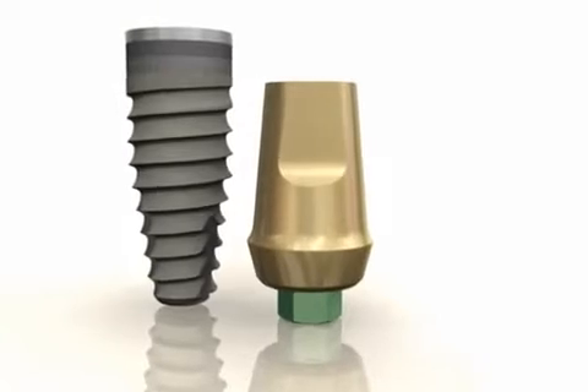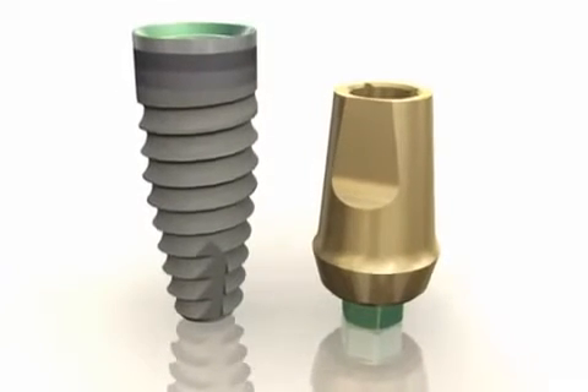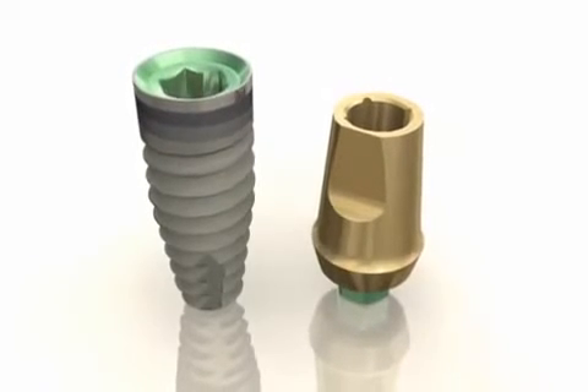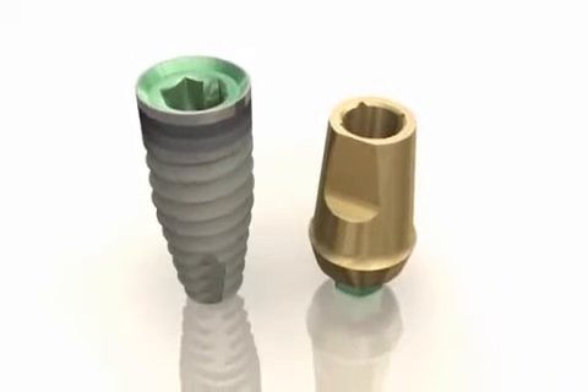The following presentation describes a typical procedure for patients presenting to the restorative dentist with a healing abutment in place. For illustration purposes, an internal hex implant is shown, but the techniques and materials are equally applicable for an external hex implant.